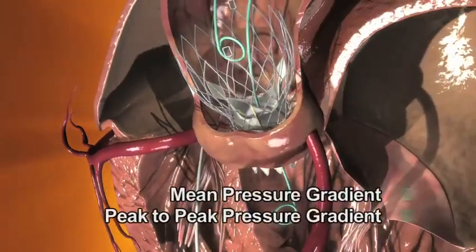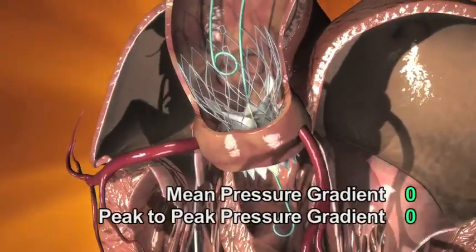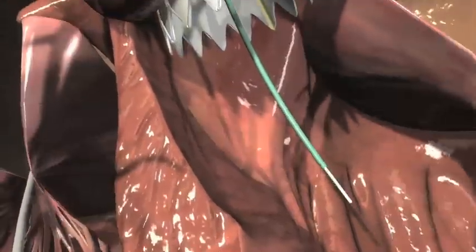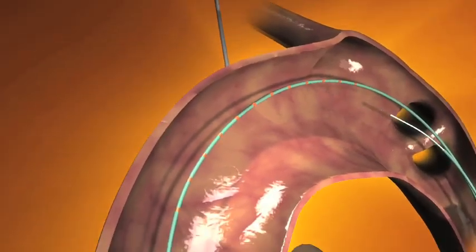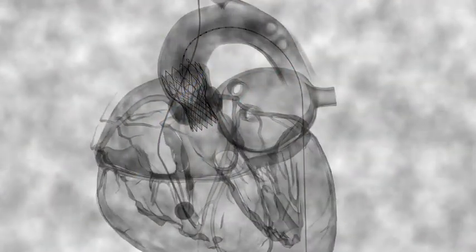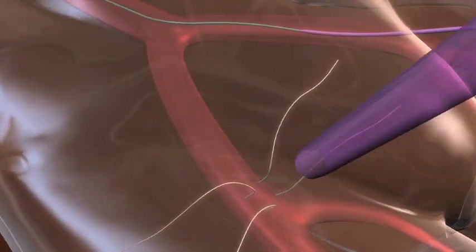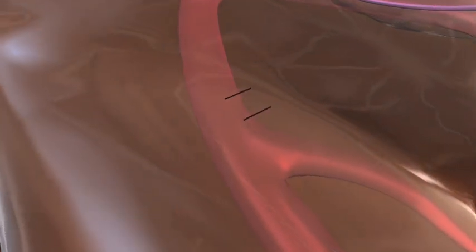Using both pigtail catheters, record aortic pressure gradient. Remove 6 French pigtail over standard guide wire. Perform post-implant aortogram with the 5 French reference pigtail. Remove the 18 French introducer sheath and complete the puncture site closure.